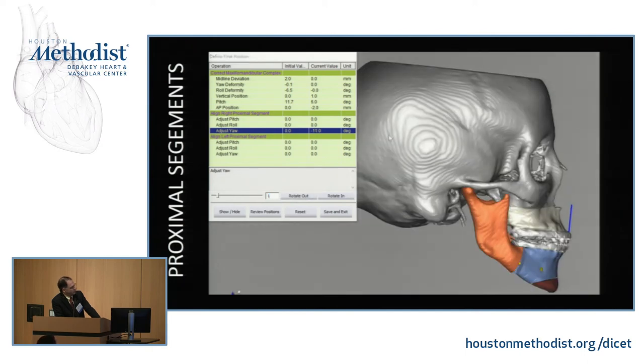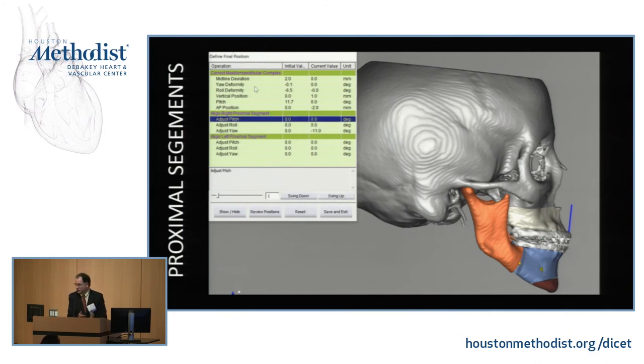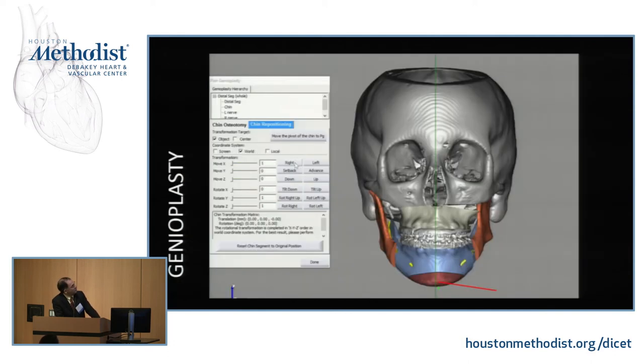There's nothing more frustrating than when you move the jaws into one position and the segments start colliding with each other and you cannot align them well. That used to happen a lot to us. It was very frustrating, and we spent a lot of time trying to grind all the little things until everything fit well. We can now avoid collisions or map them perfectly well before we go.